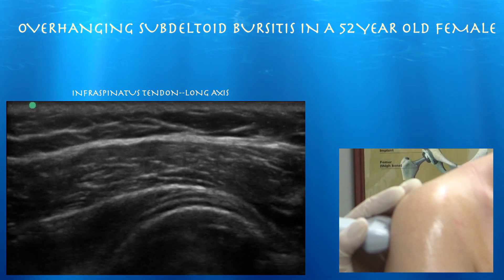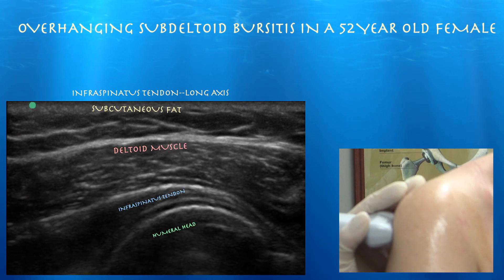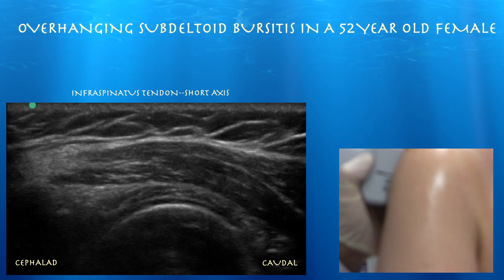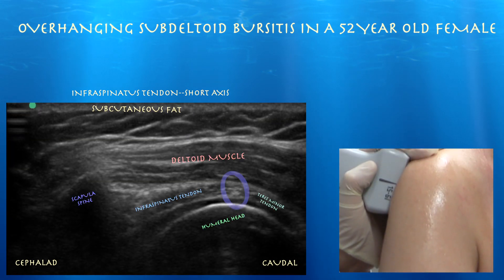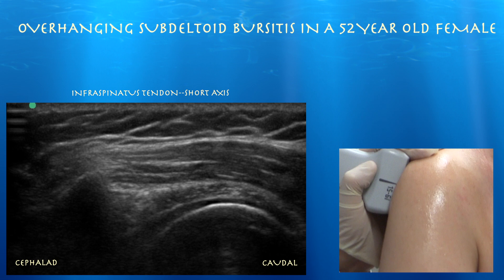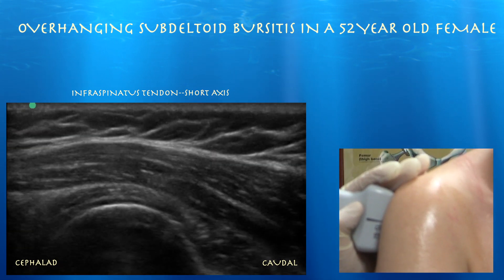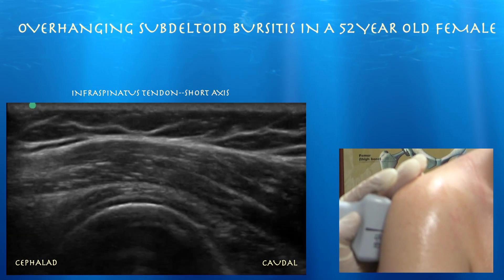The infraspinatus tendon looks intact here. Here's the posterior aspect of the shoulder — in long axis the infraspinatus tendon looks normal. Here we are in short axis, and you can see a little septum between the two muscles of the teres minor and infraspinatus. The left side of the screen is infraspinatus and the right side is teres minor. That looks pretty well preserved.